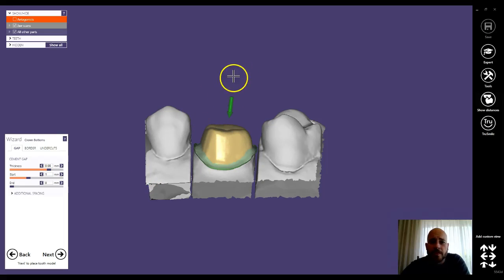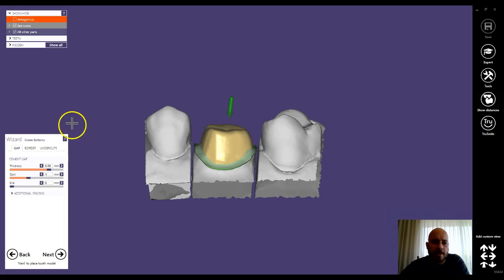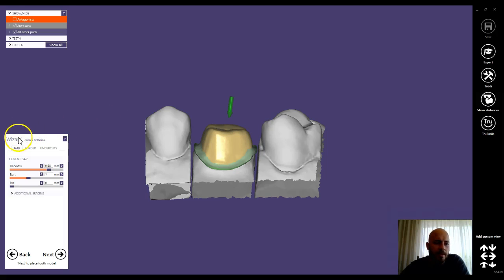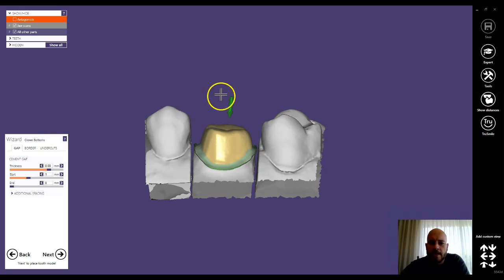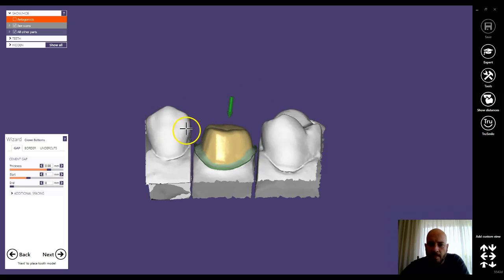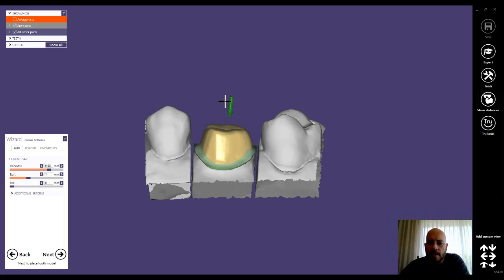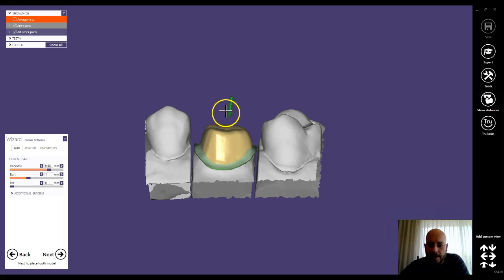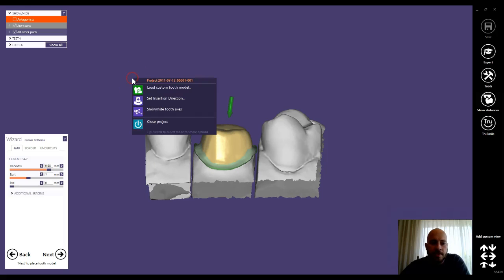One thing I like to remind people is to do their insertion at this point. So when you get to the wizard when it shows the crown bottoms, sometimes I like to show people to flip the entire model over to where they can look at it from the buckle and look at that insertion angle.